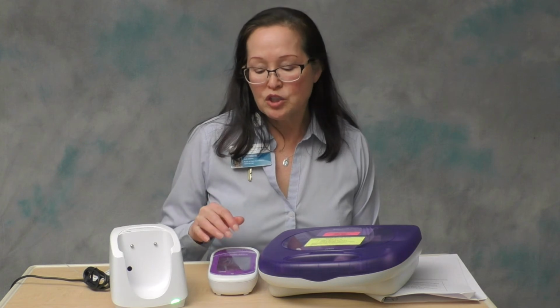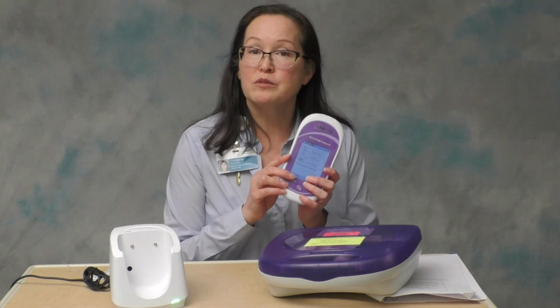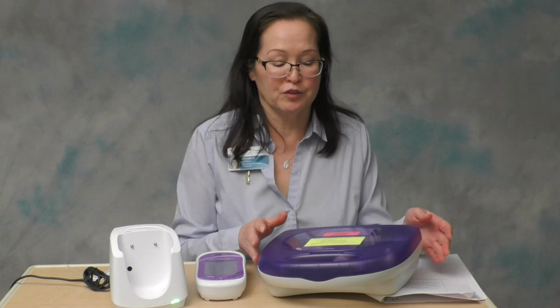These 4 conditions will cause an interference that will render the result on the glucose meter inaccurate. So if your patient has any one of those 4 conditions, you'll have to obtain a lab draw. We'll have it sent to the main laboratory where the big instrument can overcome all of those interferences.